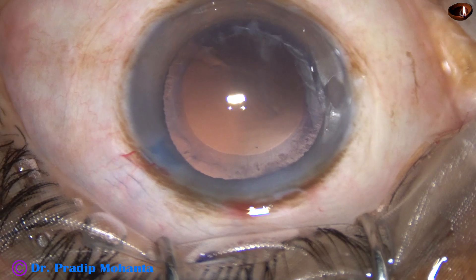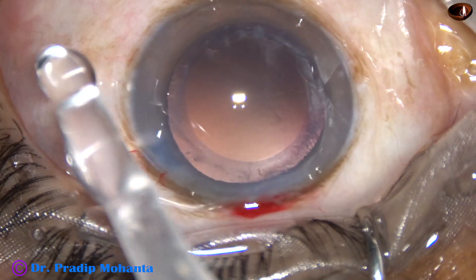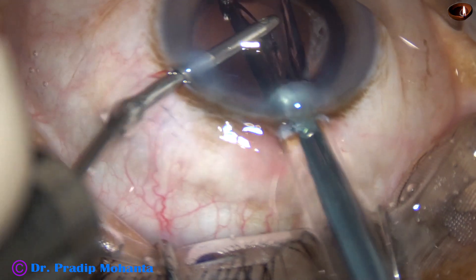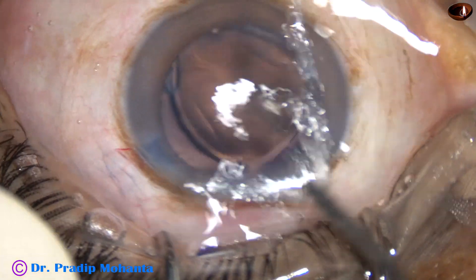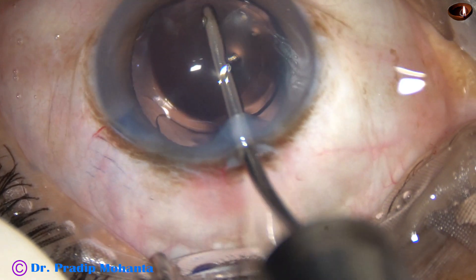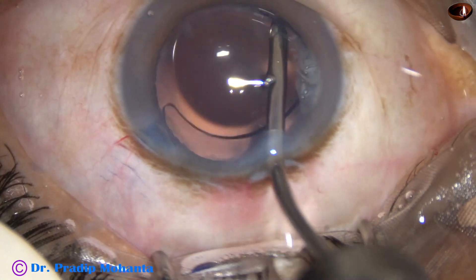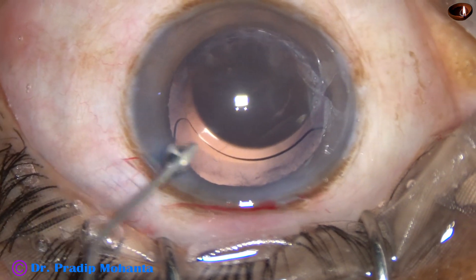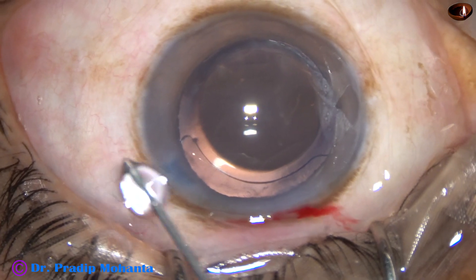Now is the time to implant an intraocular lens. This is called hydroimplantation, where you keep the anterior chamber formed by the irrigating probe of bimanual IA. This irrigation keeps the anterior chamber formed and the lens is implanted. The leading haptic goes into the capsular bag and the trailing haptic is pushed by the irrigating probe into the capsular bag. In this case, the leading haptic and optic are stuck to each other, but I hope it will get released soon and I don't have to do extra maneuvers. Still it is attached, and now as I inject Moxie I see that it is released. The lens is getting centered, indicating that the haptic and optic are no longer stuck to each other.